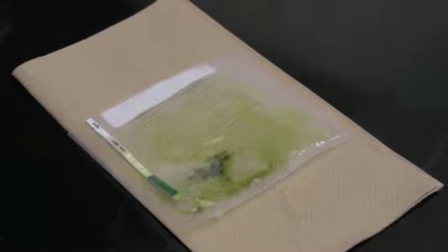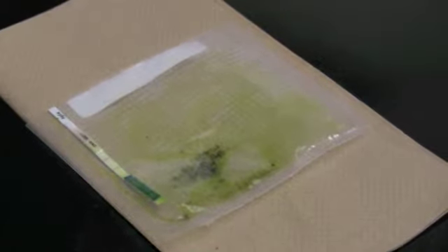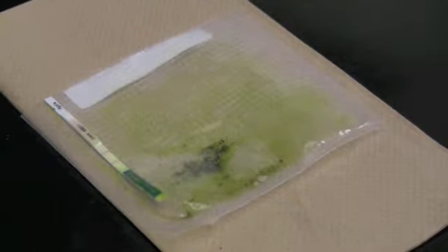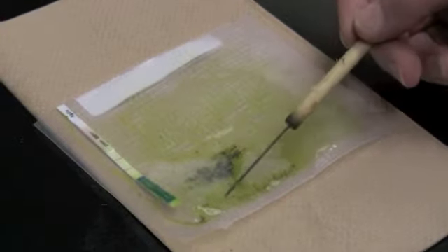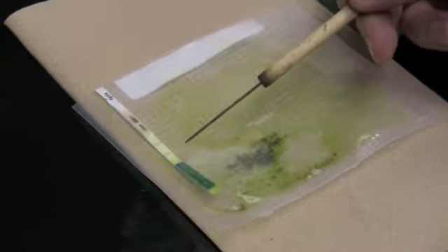So Bob, one of the concerns we had regarding the earlier tomato sample was whether or not this was bacterial canker, Clavibacter. And so we used what's called a serological test to test for the presence of the bacteria in smashed up leaf tissue. And what we see here is a positive result.